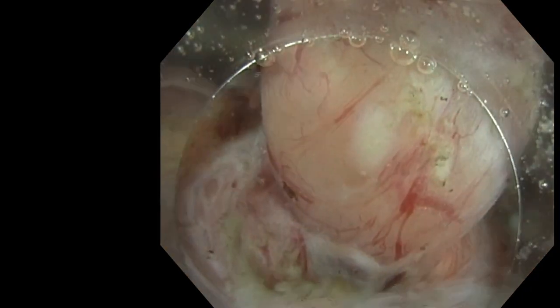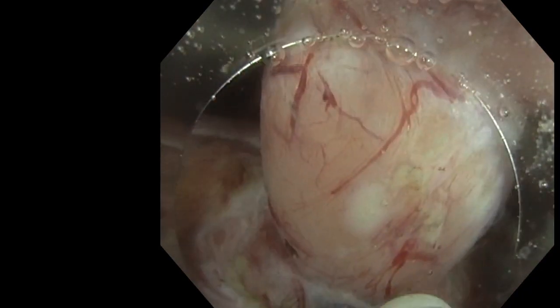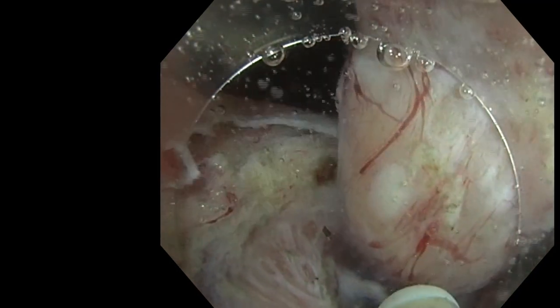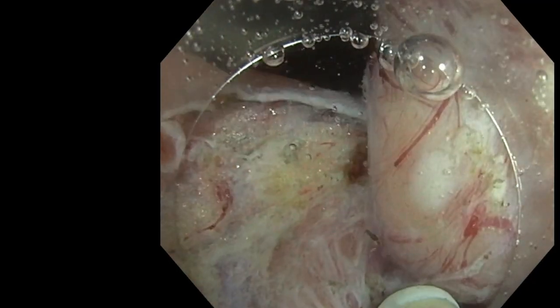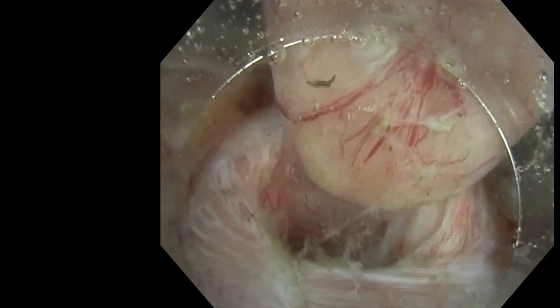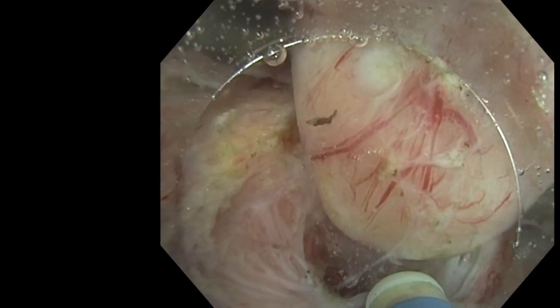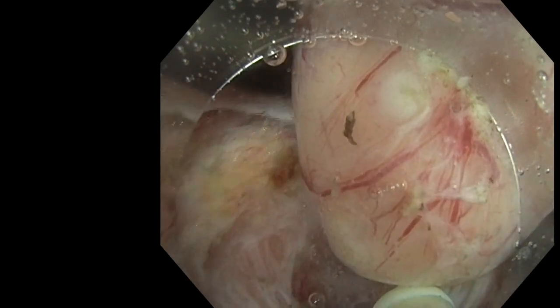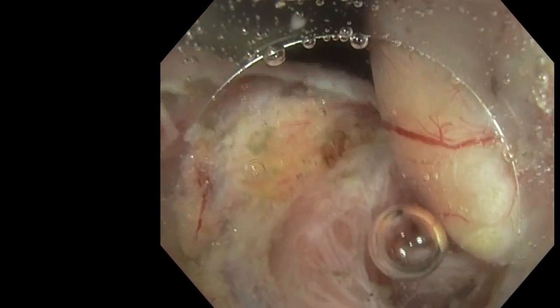This picture was important because we saw that injecting from the anal edge could open also the oral edge, showing that the bottom is almost reached, and it will be easier to achieve the resection here and cut the last fibers to remove the lesion completely.